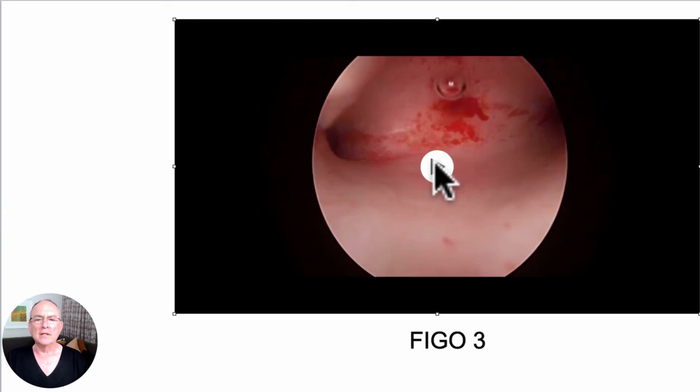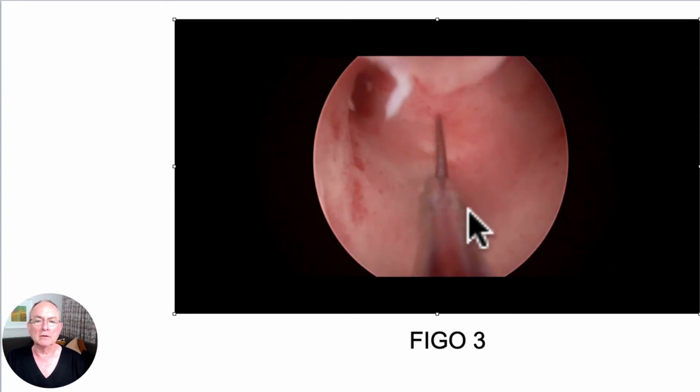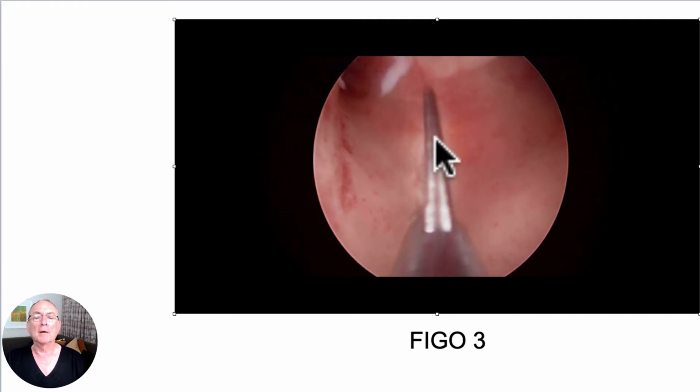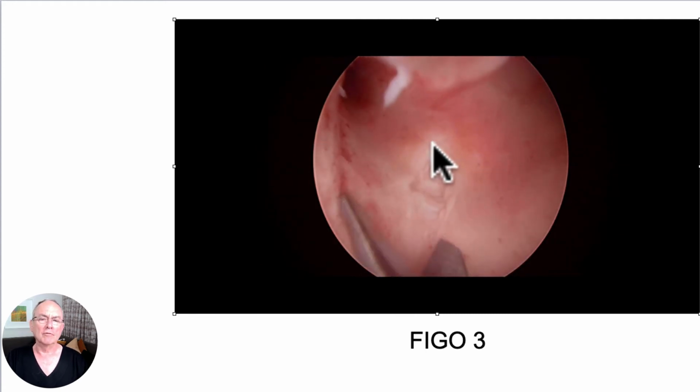I would now like to take you through my technique of removing a FIGO 3 fibroid. And what's important is to increase and reduce your pressure to watch the bulge. And there you'll see the bulge. And I open up the endometrium, and I think it's very important not to take your TrueClear and apply it straight to the endometrium and gobble all your way down to the fibroid.